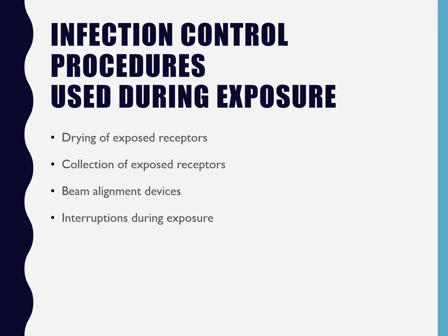You need to dry it off, and so it's important for you to have a towel over by the computer in order to dry that sensor off, because you don't want that saliva to drip on other things, and you don't want to have it just sitting out and being gross. And so you're going to dry off the sensor.